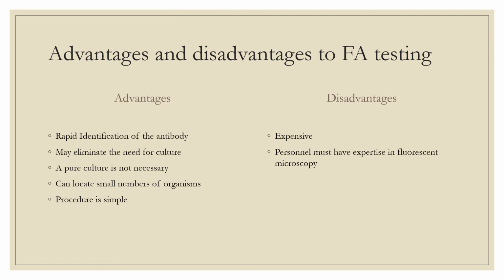Some disadvantages of fluorescent antibody testing, for one, it's very expensive, and personnel must have a great deal of expertise in fluorescent technology and fluorescent microscopy in order to view these samples.